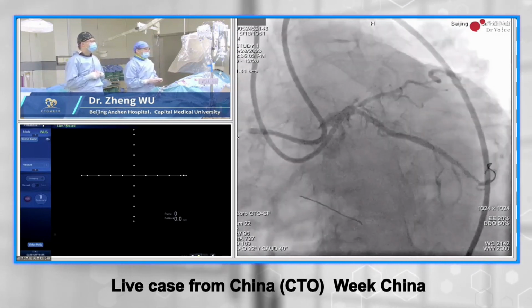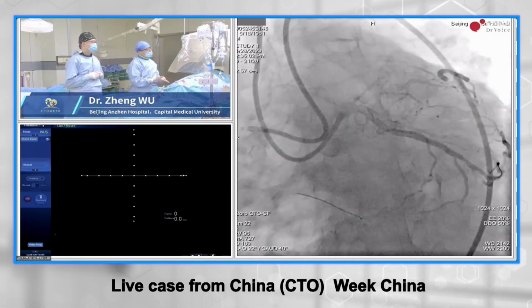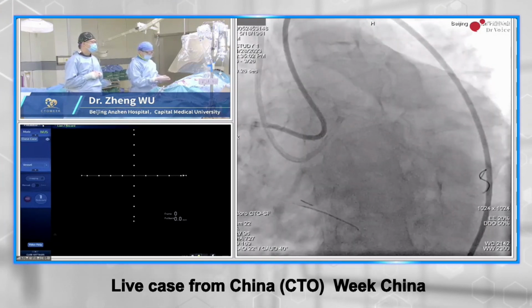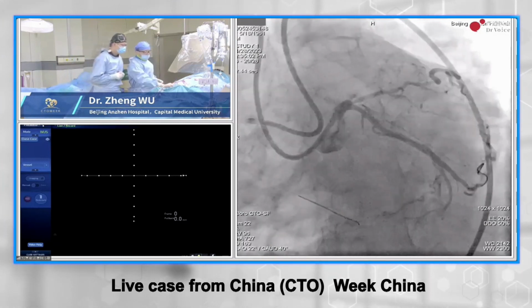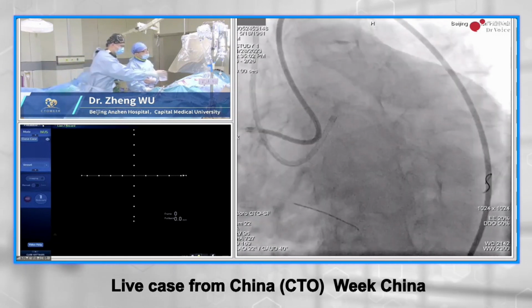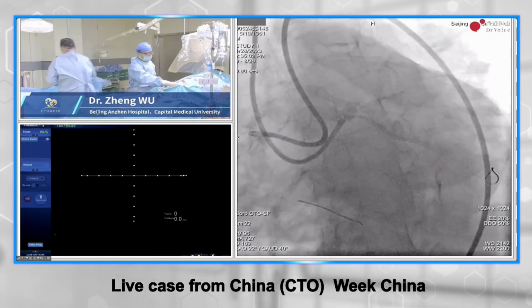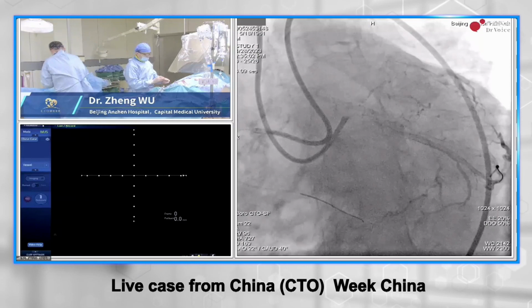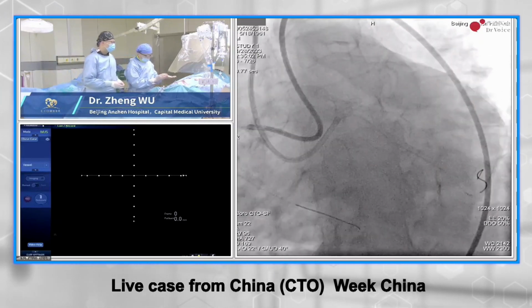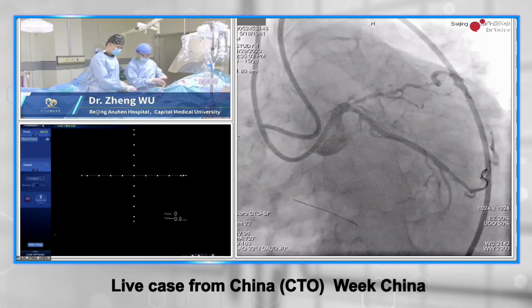Thanks for your introduction of this case, and thanks, Dr. Ovik. Great work. We have a good opportunity to communicate with each other, with Pakistan colleagues. So we have several minutes to discuss this case. Can we have some suggestions from the Pakistan colleagues, please?